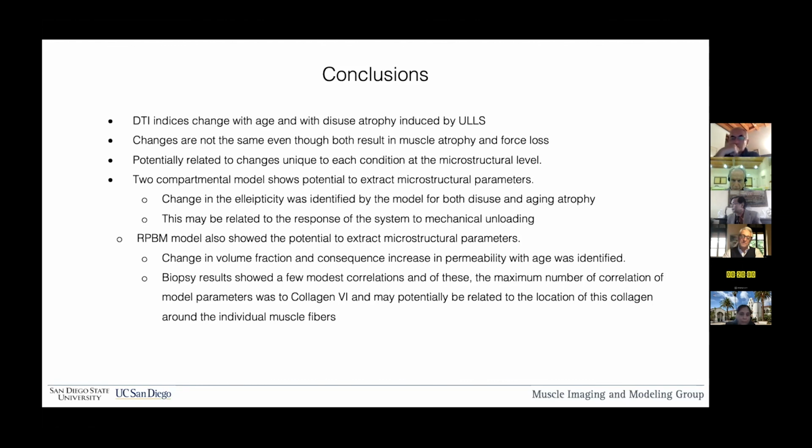So to be able to align them exactly along the fiber, we'll be able to get parameters of, say, radial expansion. What we are saying, Marco, is that the shear strain that we measure from the strain measurements is related to the shear in the endomysium, though we don't have a way of pinpointing through the measurements where the shear is coming from, because a voxel contains hundreds of fibers and connective tissue.